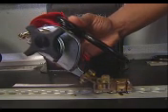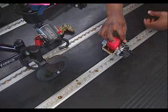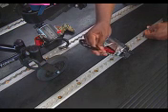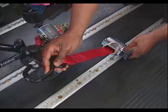Install the track fitting end of the front strap into the floor track. Use a slot that's at least 3 inches outside the wheel. This prevents the strap from interfering with the footrest and gives better stability.